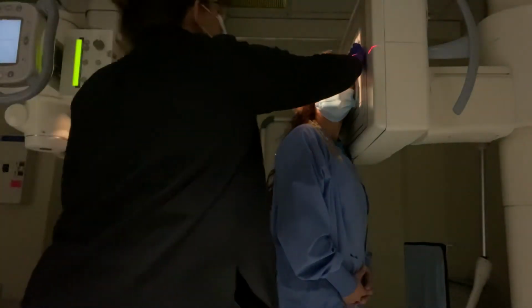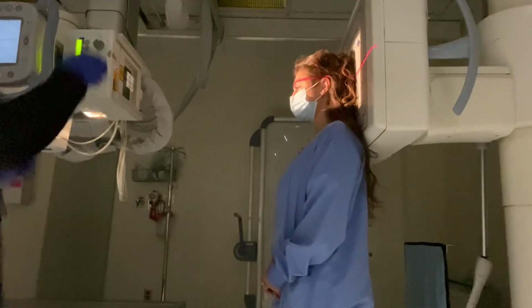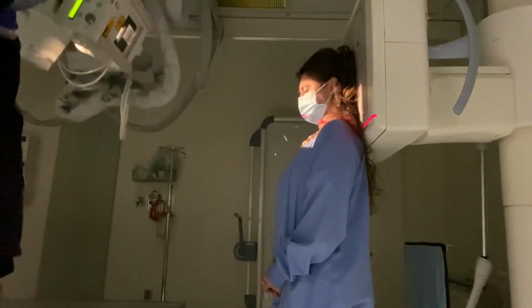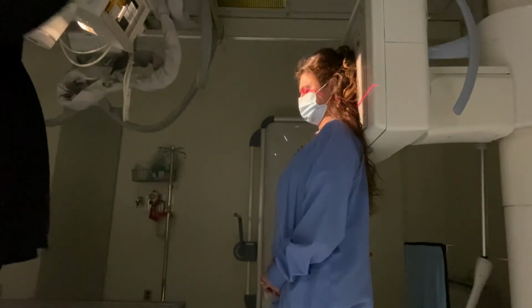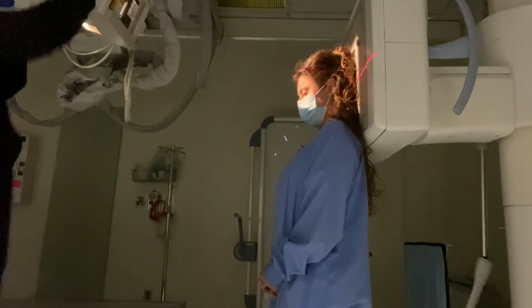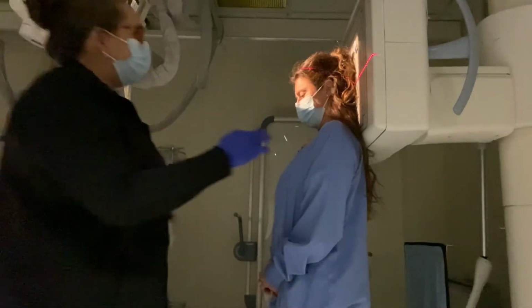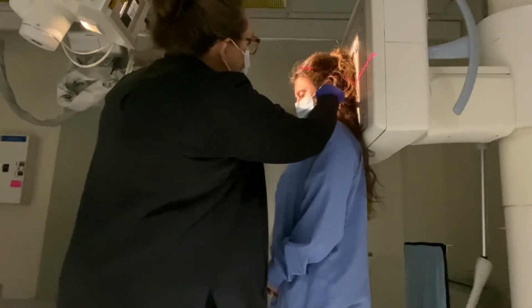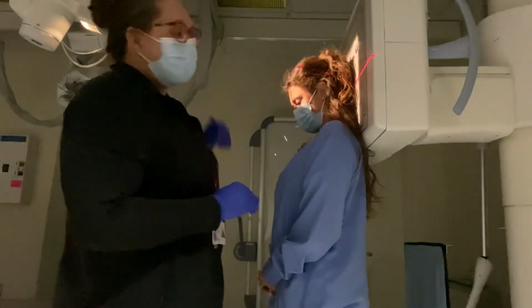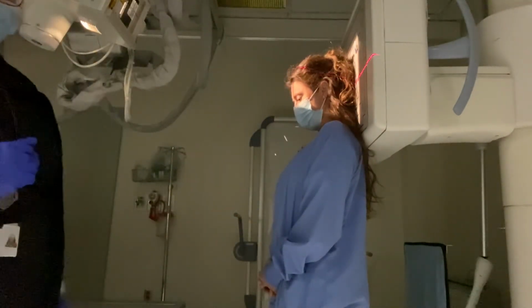Then I would turn them around and put their back up against there, and then we're going to do the AP Towns. So for the AP Towns, we use a 30-degree caudal angle. We're going to have the patient tuck their chin down towards their chest a little bit. And then what we want to do is we want to make sure that the orbital meatal line is perpendicular. So you're going to come right in here and again take that imaginary line. Can you tuck your chin just a little bit more? Sometimes we can actually put a sponge behind the patient's head to help them. A little less. Okay. All right, so making sure that orbital meatal line's perpendicular.